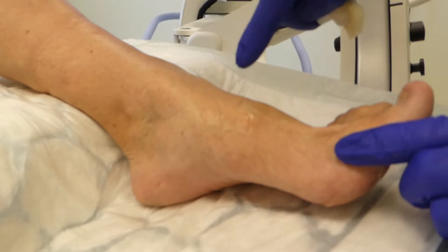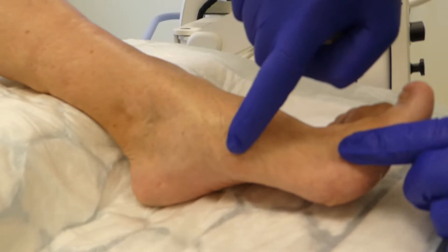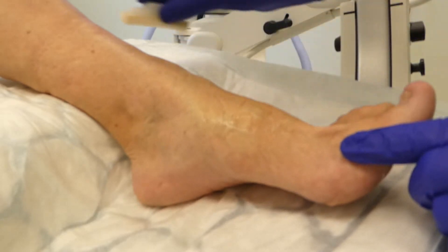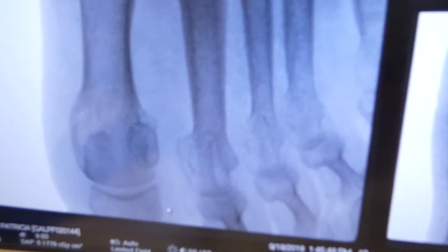So this lady's pain — she'll be unnamed. She's got pain here over the first TMT but also pain over the second. I've done a little check X-ray just to show you where she's sore — it's up and around the first and second TMT. Bit of arthritis; you can see the arthritis here and here.